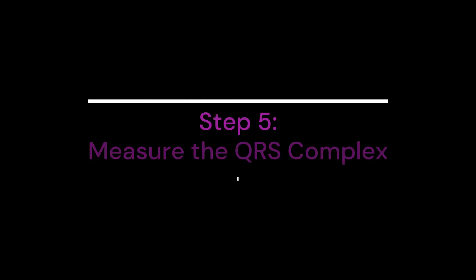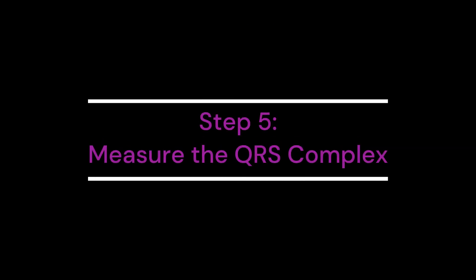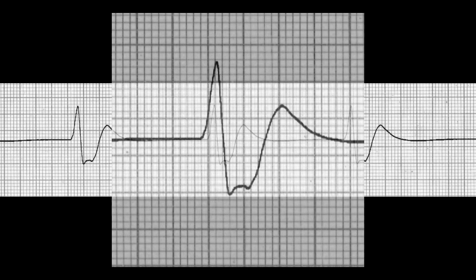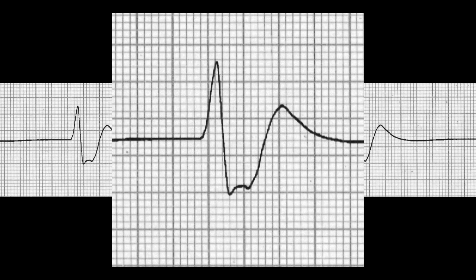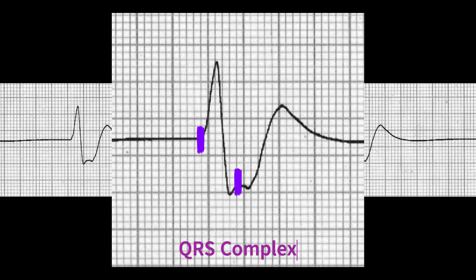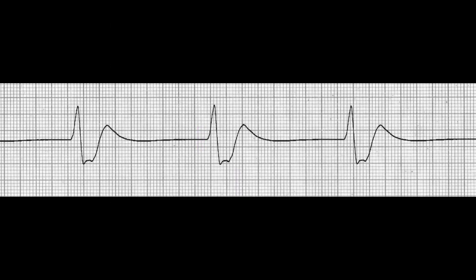Step 5: Measure the QRS Complex. Idioventricular rhythm appears with wide QRS complexes, usually measuring greater than 0.12 seconds, giving the QRS complex a somewhat bizarre appearance. This is a hallmark finding of idioventricular rhythm.